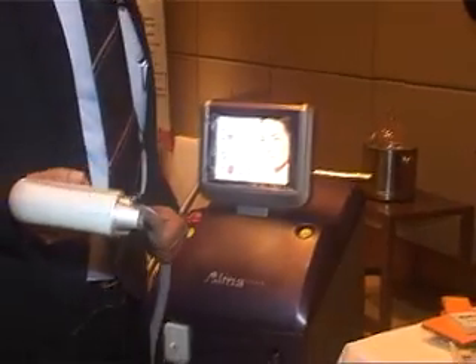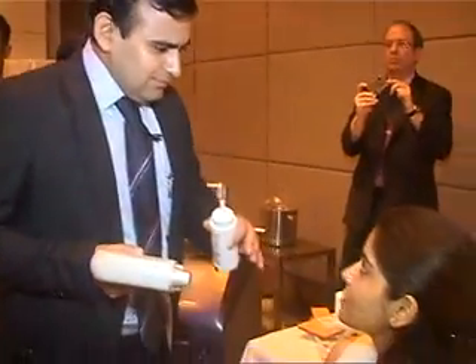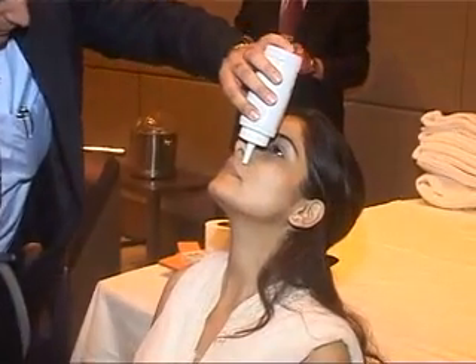The machine is on active mode now. We require a gel for this. Let's close your eyes — now we will put some gel here. Tilt your head back a little bit.